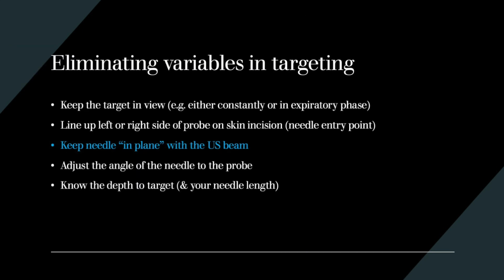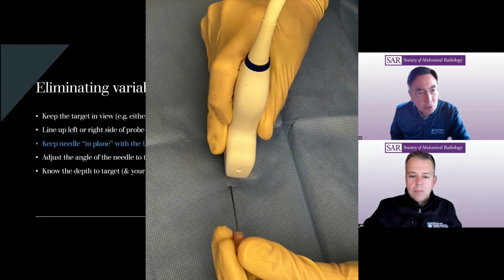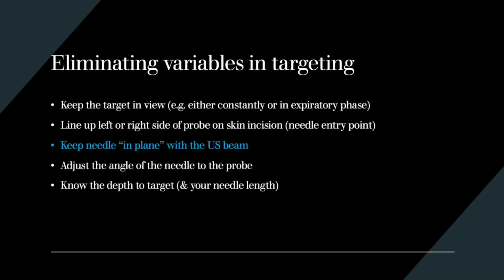So the next variable is keeping the needle in plane with the ultrasound beam. This is one of the hardest things, I think, for novices to get used to. And that's because even if we're holding the ultrasound transducer in a stable position, our hand is resting on the patient, our other hand is holding the needle, and that hand is necessarily floating in midair, so to speak. It is very common that the trainee has that needle drifting in and out of the ultrasound plane. With experience, you will tend to do that less, but you do have to visually check every now and then to make sure you're in plane with the transducer.